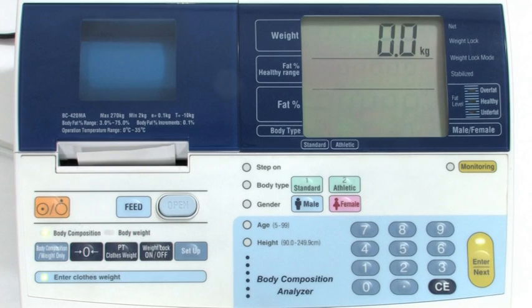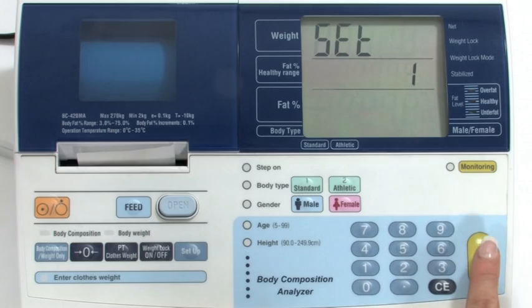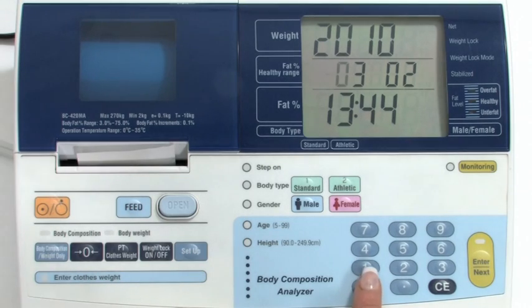There are default settings for your analyzer. However, if you wish to set the date or change the default settings, you need to enter the setup mode. To set the date and time function to appear on each measurement, press the setup key. Input one and then the enter or next button. Using two digits, input in order: the year, month, day, hour, and minutes.